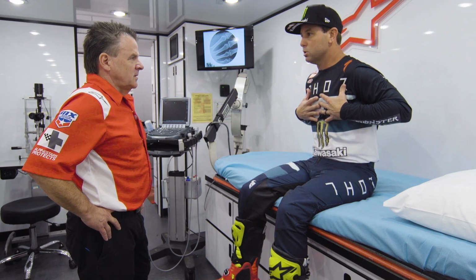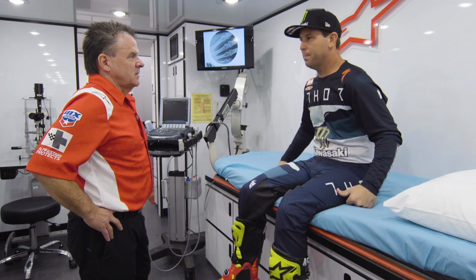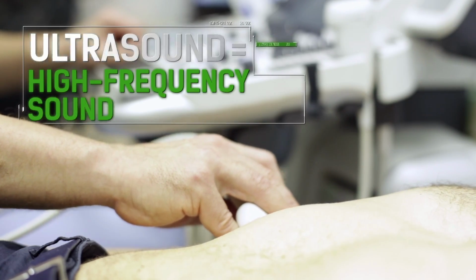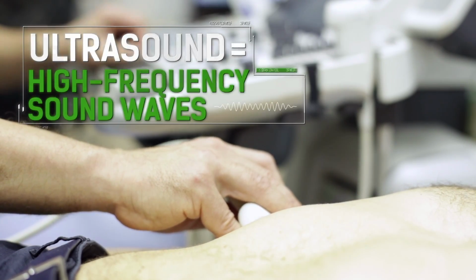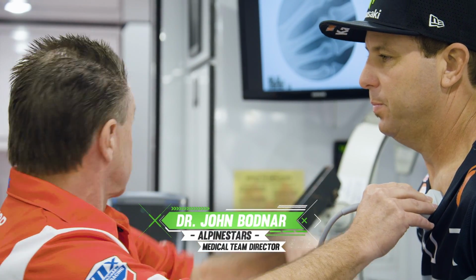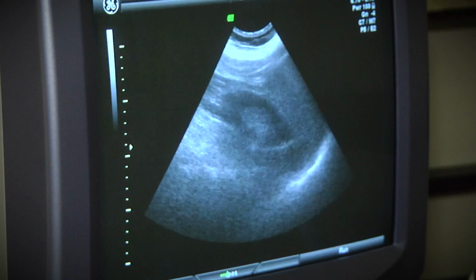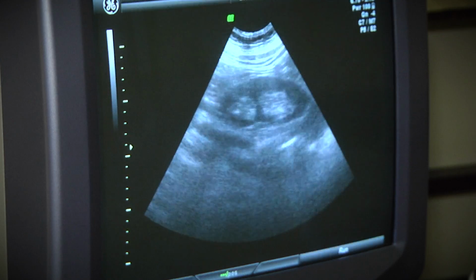Say my chest hurts, I have a hurt shoulder, and my collarbone's hurting. Where do we go from there? First off, we probably do an ultrasound, just take a look at your chest. Those ribs slide back and forth, or the tissue between them and the lining of the lung. If that lining doesn't look right, I would say, oh, that lining's not touching the lung, that means it's dropped down. So this is a really simple way to find out if you have a collapsed lung.